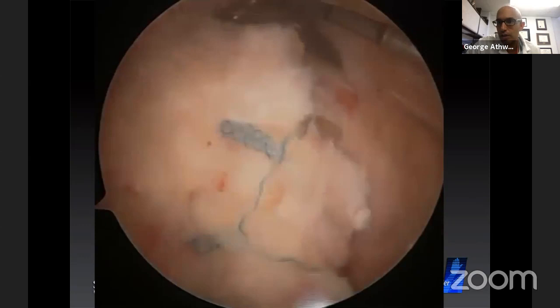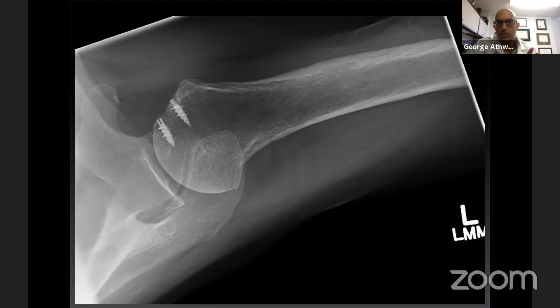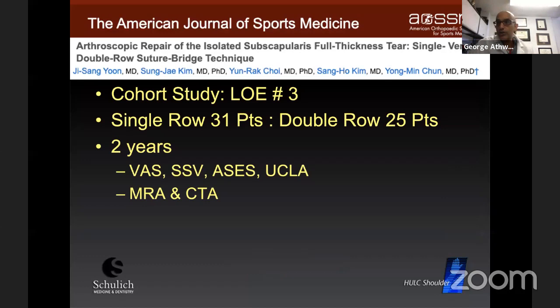And there's two metallic medial suture anchors, and my lateral anchors were PEEK. So that's why we can't see them. So what about the literature comparing single versus double row for subscapularis? This is an excellent study.